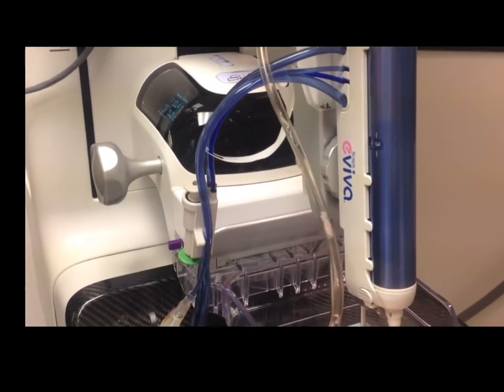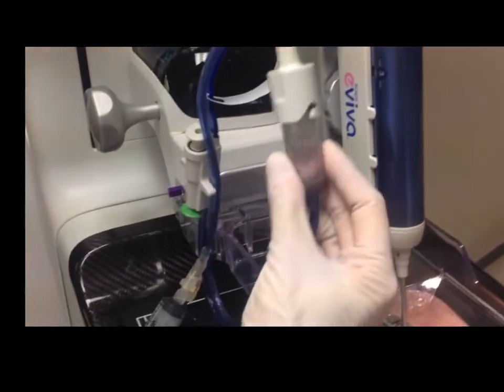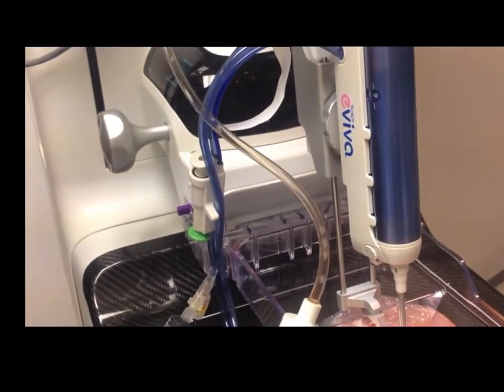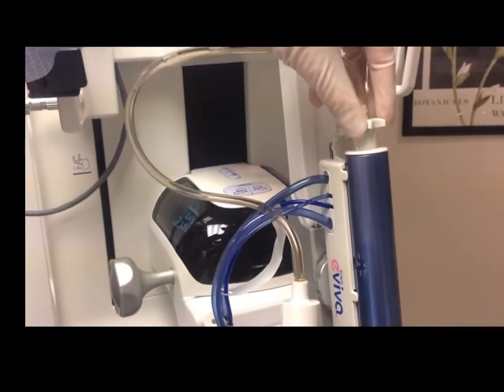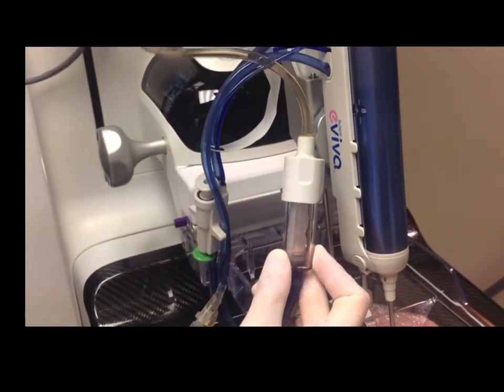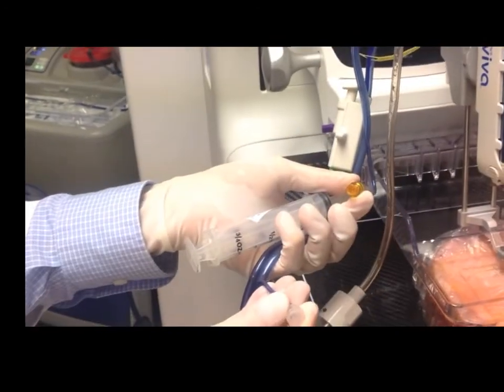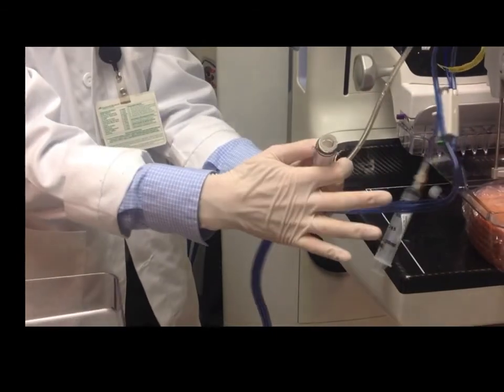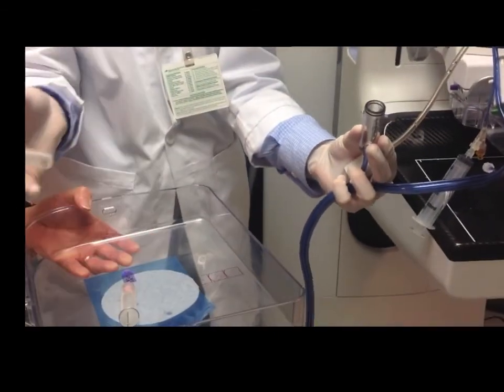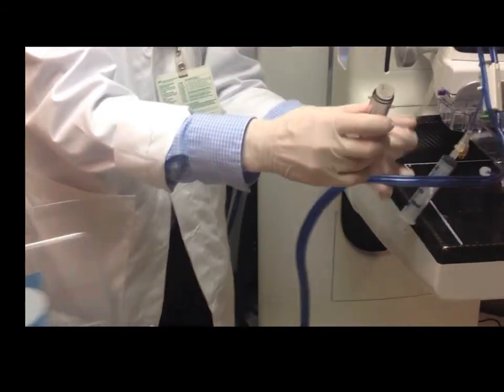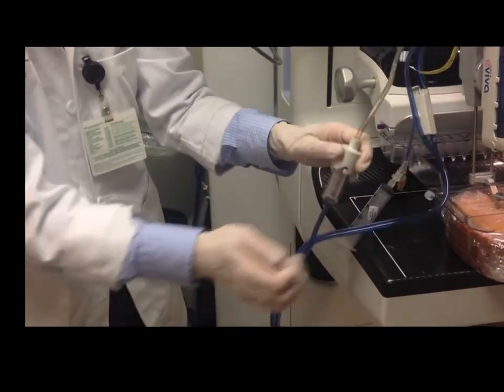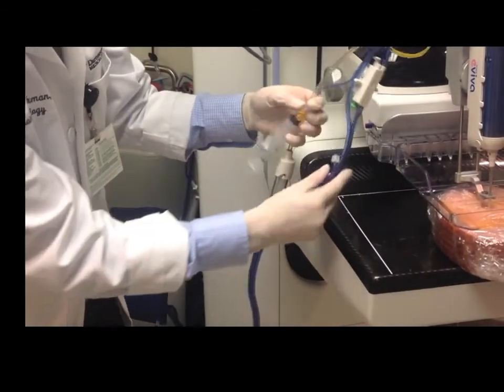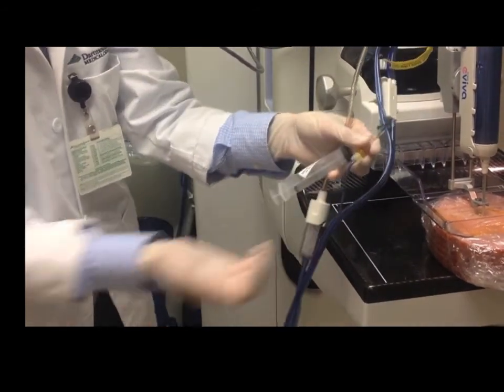As the lavage mode runs, you will see one or two more additional specimens running through the tubing down into the specimen pot. This is really important to get those last specimens. Make the specimen pot a little dependent to help the flow and gradually turn the needle around in the patient to irrigate the cavity. Undo the gold connection and that will flush the last of the saline into the pot and you can then remove the basket, replace it with a second clean basket and reattach your saline flush. At the end, keep some irrigation going while you check the specimens.